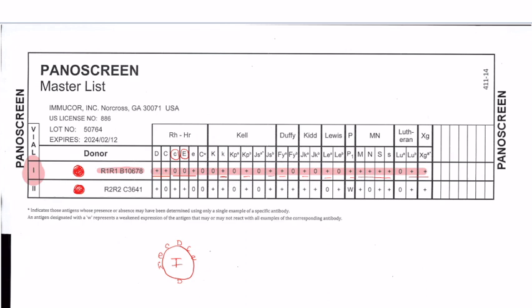And 2, on the other hand, so if we look at screening cell 2, let's draw a picture of it. There's 2. As we look at this one, I'll highlight it in a different color right here. This is screening cell 2. Remember, we just have to look at it as a map. This one also has D on it.